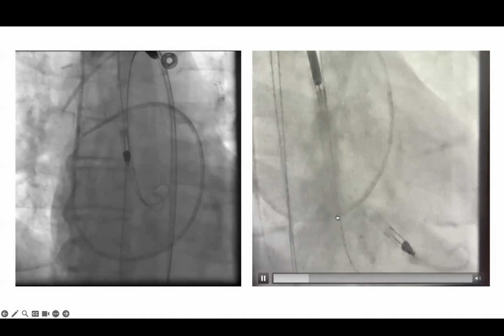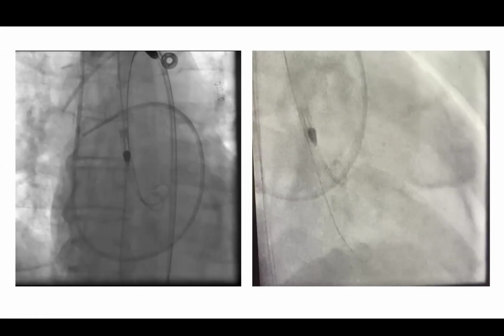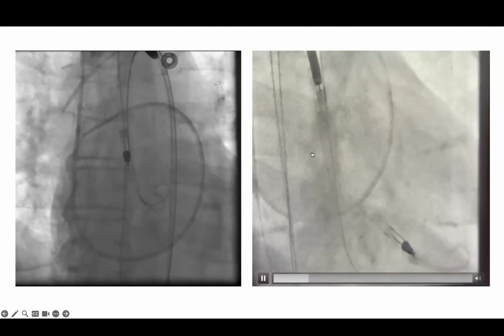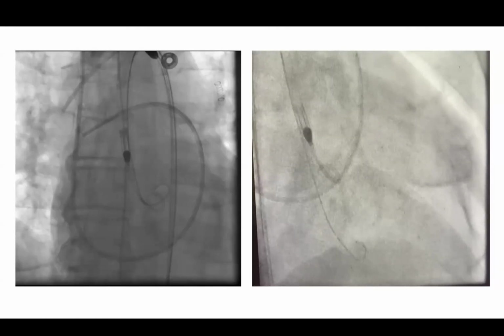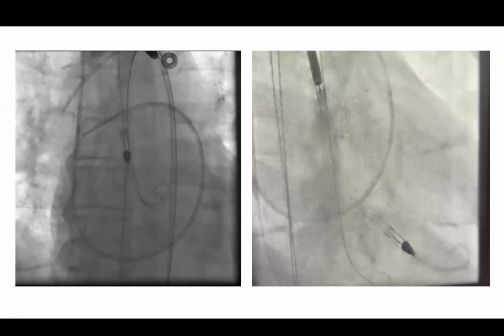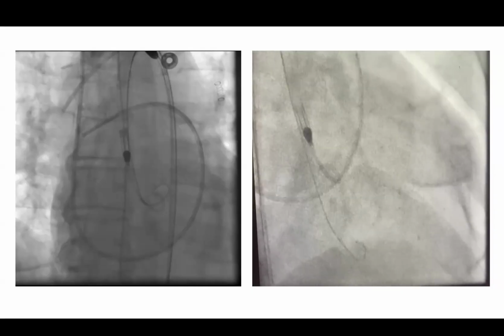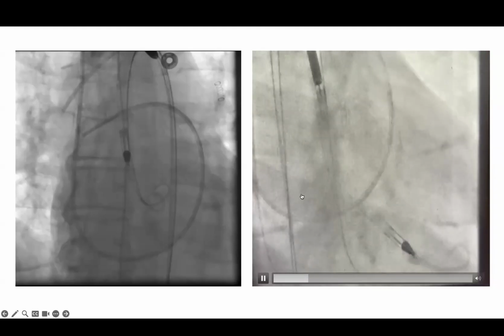The wire is across the valve in the LV. I think of it like a buddy wire type of thing. We tried to push that without the wire, but it was starting to buckle. Josie was like, whoa, stop. Does the wire give some structure to the catheter so it's less kinkable? Not really, because it comes out before the actual impeller. It's an 035, yeah.